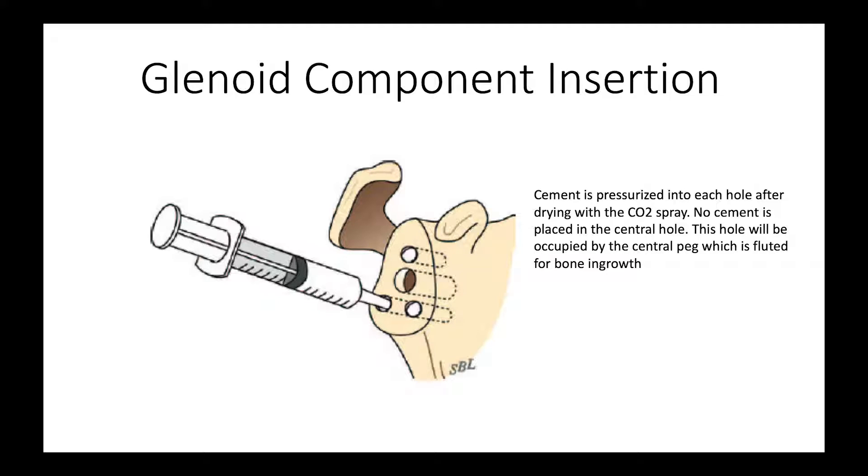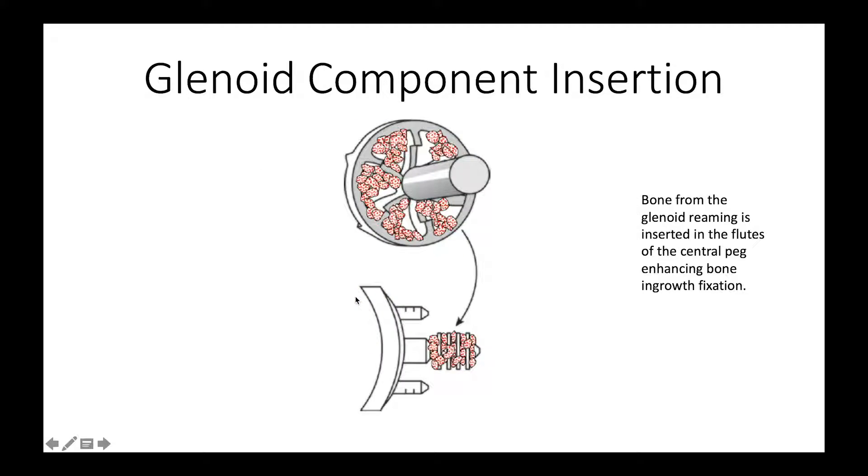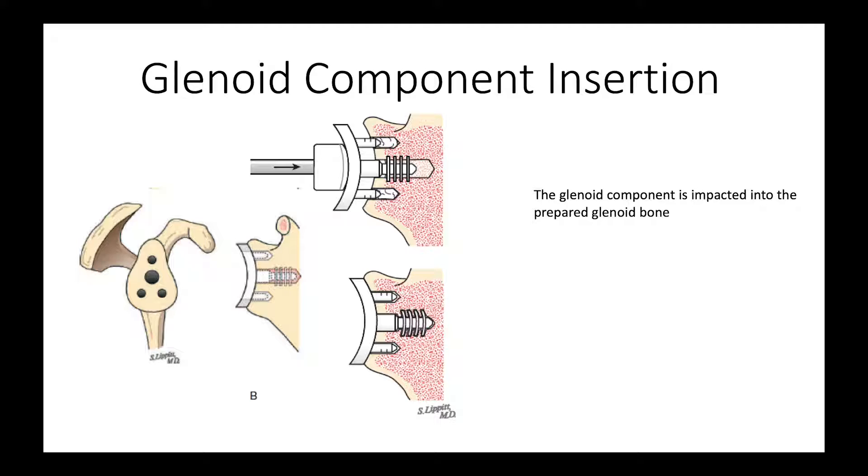Here we are pressurizing each of the holes and putting cement in there. There's no cement in the central hole because that one is going to be fixed with the fluted peg. One thing we have to be careful of is if one of the holes goes out the back or front — we want to avoid pressurizing it too much because there are nerves nearby. The CO2 spray gun also helps us identify leaks in the bottom of these holes, and if we identify one, we're very careful just to fill the hole rather than pressurizing it. Here again are our glenoid reamings which we put in the peg, and then we drive the peg home and now we have secure fixation of our glenoid component.